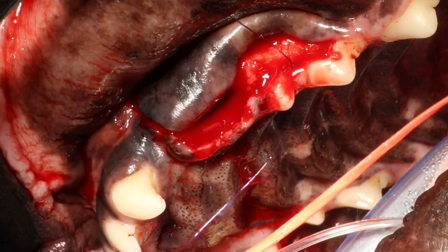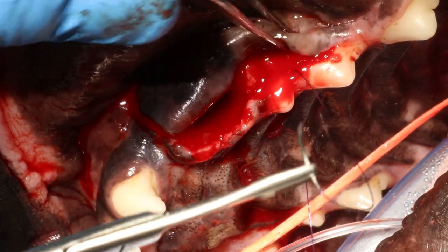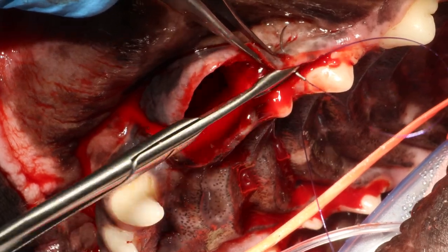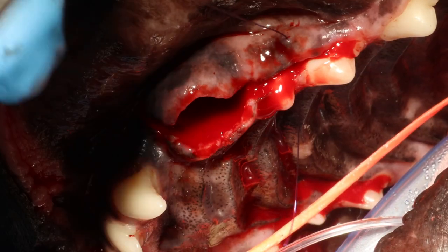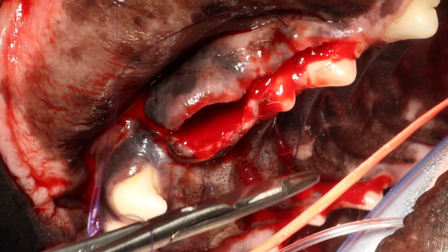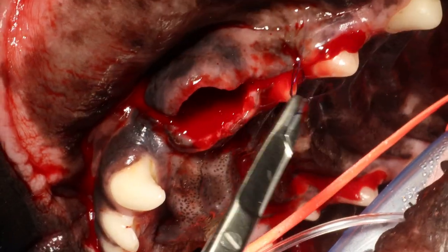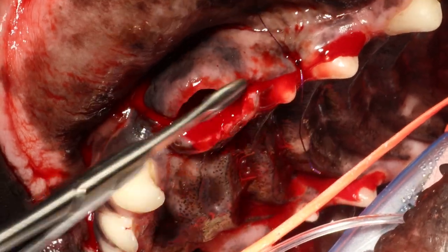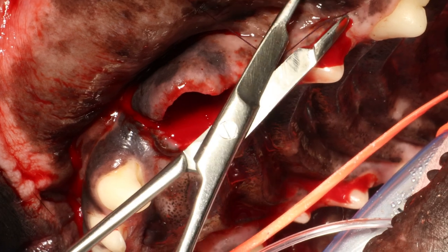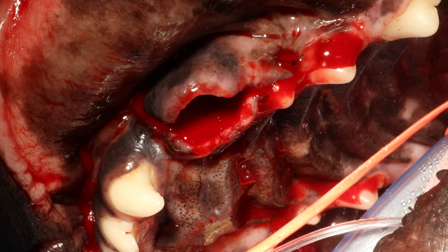I'm using Monocryl 4-0 on a reverse cutting needle. I like the suture to be dyed purple so I can see it in the oral cavity — many Monocryl sutures are undyed and clear, which makes them difficult to see. I like to put in 4 throws for each knot and leave the ends around 3-4 mm long.